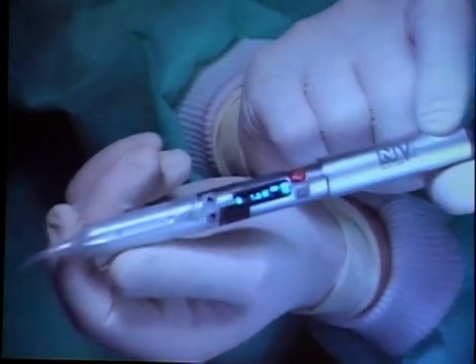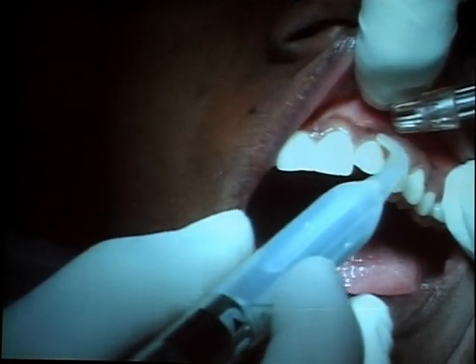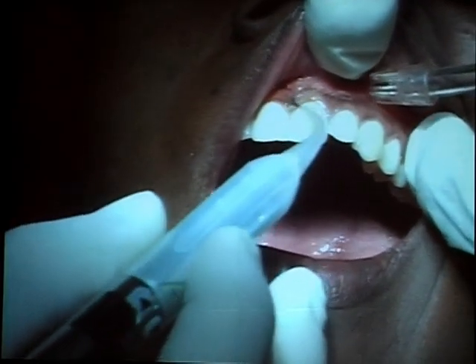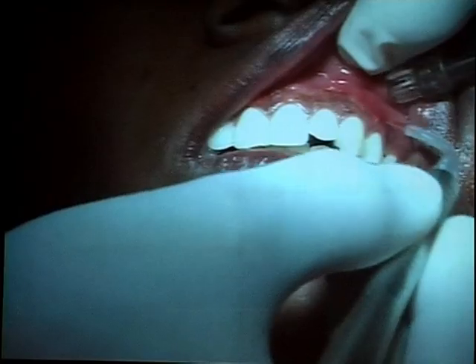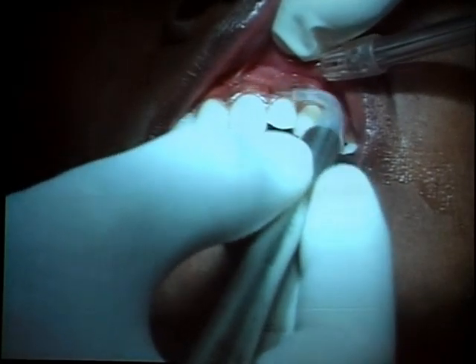And it's now put to 1 watt continuous wave mode. Okay, that's it.